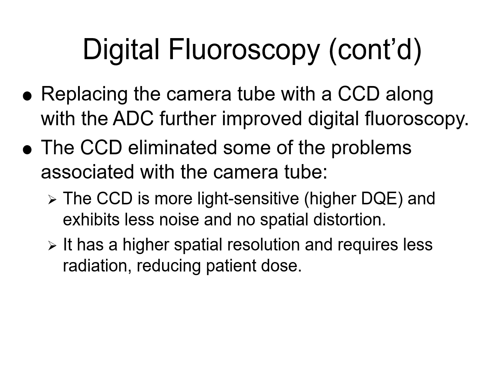Because the final image capturing sensor is more sensitive than previous technology, we can get away with a weaker signal, a weaker remnant beam, and still get a good image. So it's basically improving the efficiency of the image intensifier.